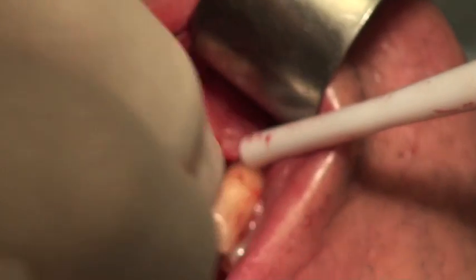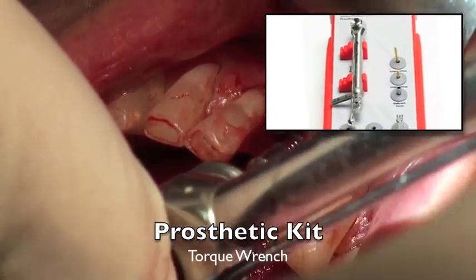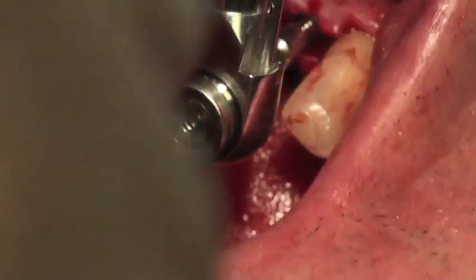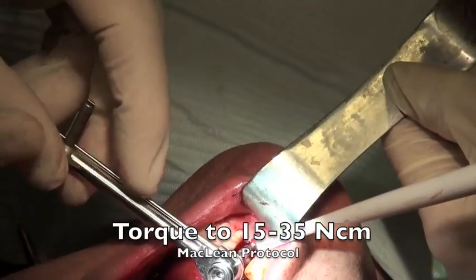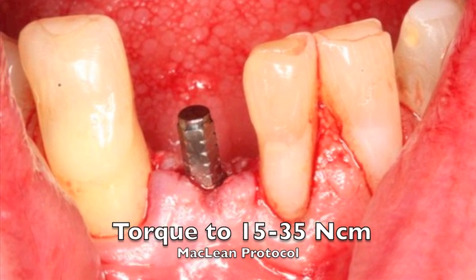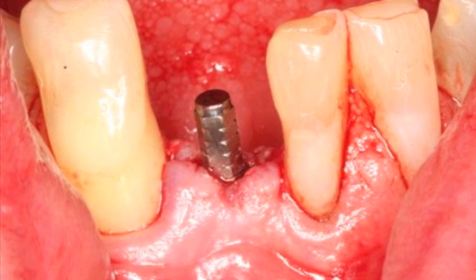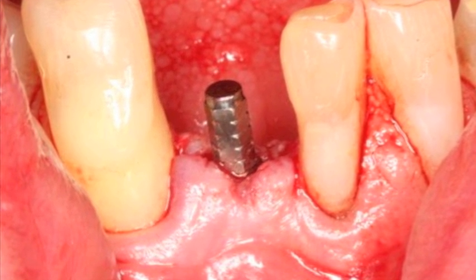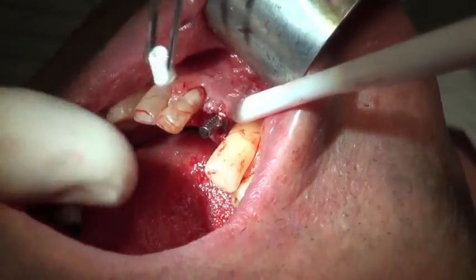For the prosthetic kit, we use the multi-unit driver. The multi-unit driver is placed down on top of the hex of the immediate temporary abutment, allowing us to torque this down to between 15 and 35 Newton-centimeters — I've been typically using about 15 to 20 Newtons. Looking at the implant, the abutment is very parallel with the two adjacent teeth, which is important for cement-retained restorations on temporary abutments so we can slide them on and off.